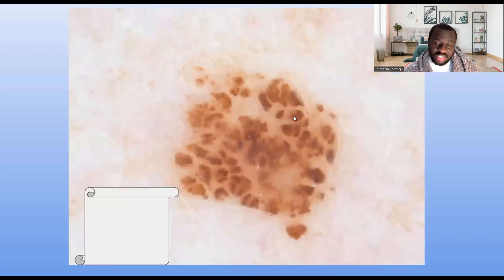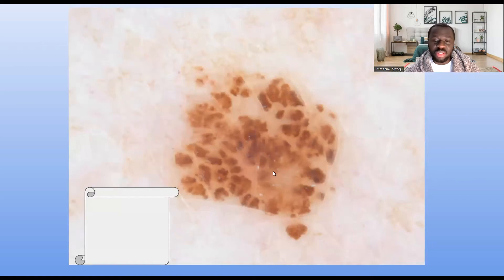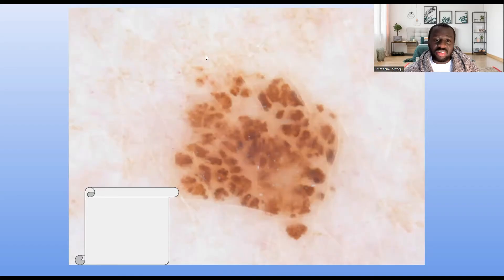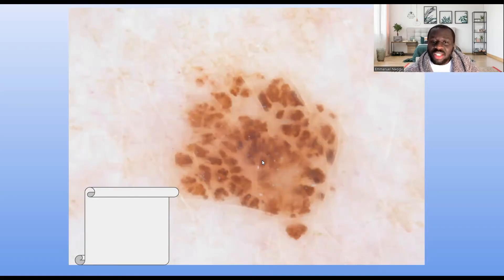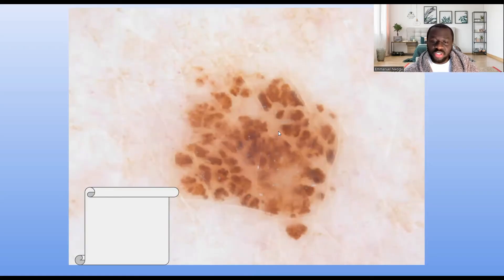Let's have a look at this one. You can see the appearance of pigmented globules — if they are smaller we might call them dots. The margin is regular and it's symmetrical; drawing an imaginary line divides it into equal halves. The level of pigmentation appears uniform; nothing is really screaming at you as different. There is some regression — you can see an absence of globules in one area — but overall you'd say benign melanocytic nevus.